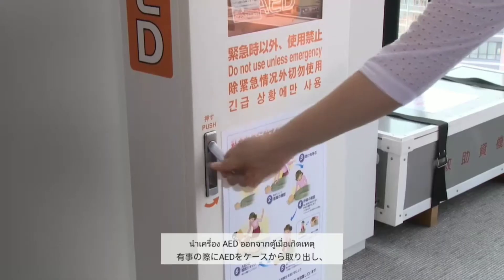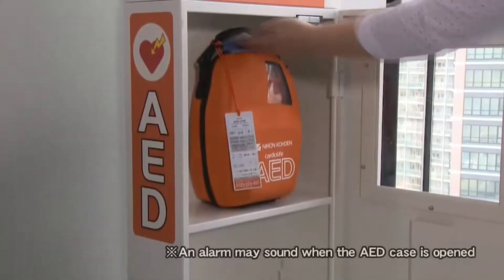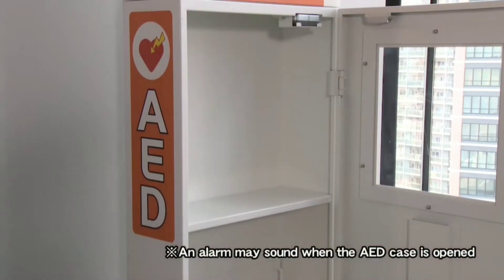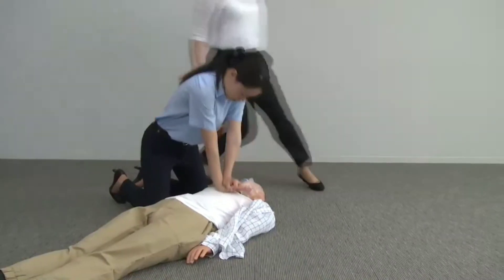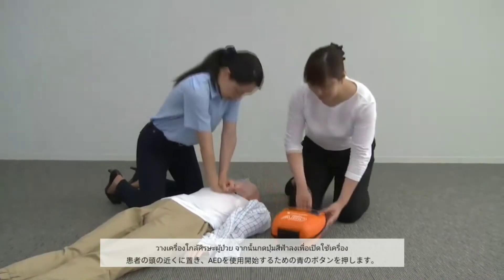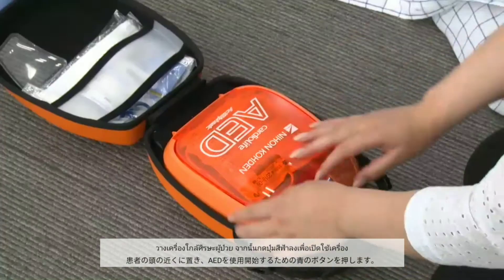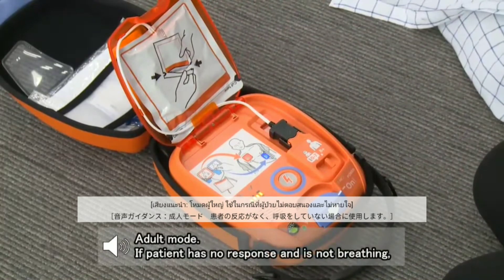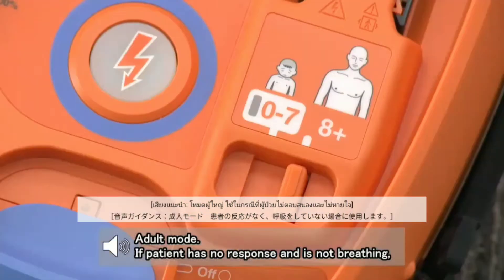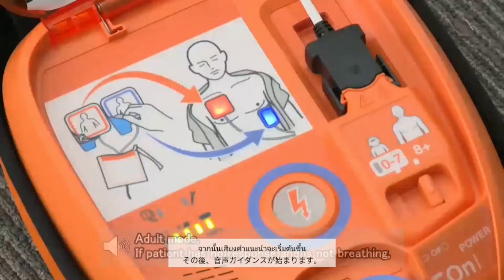Remove the AED from the storage case and place it close to the patient's head. Pull the power switch towards you — the lid opens, the power turns on, and the voice instruction starts.